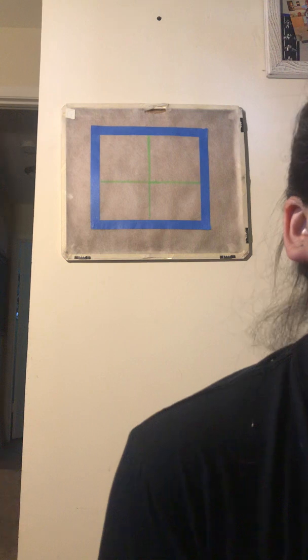And this one, when they're going across, they have the patient actually looking away. There also is a PA clavicle that you can do. Knowing that the clavicle is right here, for this one I might have had to be a little bit lower just from how high this cassette that I'm using is. The central ray is directly perpendicular to the middle of the clavicle through the center of the film. And this is pretty much just getting a view of the clavicle.